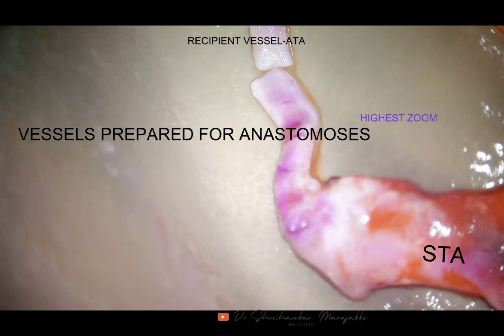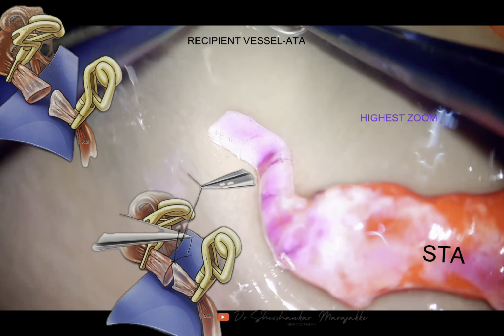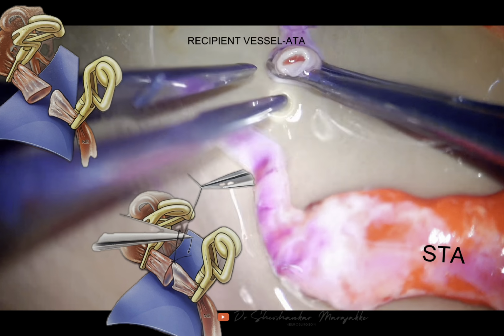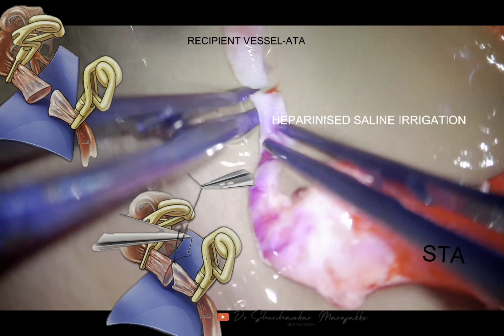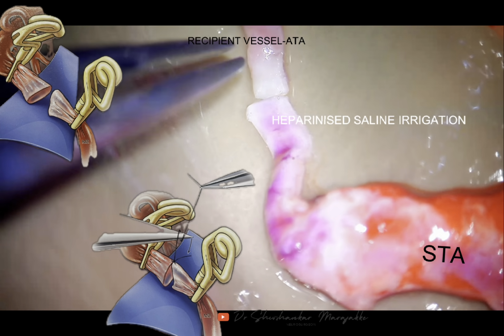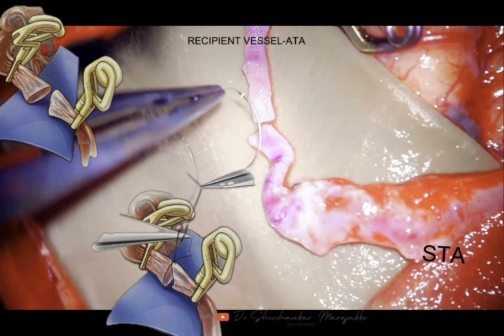The end-to-end anastomosis is circular. You can see the transverse end, which gives it a third dimension that end-to-side and side-to-side bypasses lack. The longitudinal arteriotomies and quadrangular fishmouthings associated with those anastomoses give them a linearity that yields a simple flat suture line in side-to-side and end-to-side.